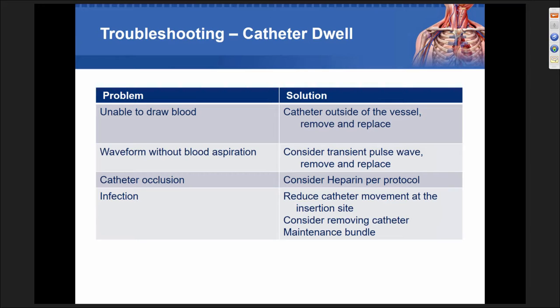This normally happens when catheters are not secured appropriately, have a large external segment, meaning they're hanging out further than they should be outside the exit site, or aren't well dressed, so the catheter can freely move. When this occurs, the catheter goes in and out, clean, dirty, clean, dirty. Then bacteria from the skin outside the insertion area migrates over the body of the catheter and transcends into the bloodstream. So it's very important that we keep our catheter secure and maintained at the exit location without a lot of movement. I'm not saying to put an arm board on the patient. I'm saying to make sure your catheter is stable.